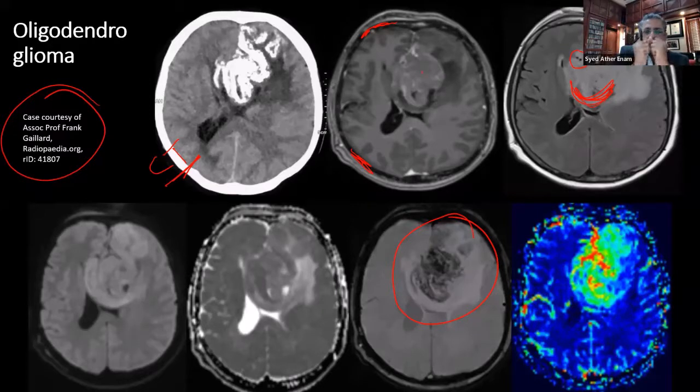But if the molecules are held in one place, and you excite them, and then you change the angle of the magnetic field, doing it exactly opposite, they will still be the same. So they will cancel each other out. And that is what you see as dark, because there is no movement of that water molecule. From the initial B0 to B1000, as you enhance the effect, it will not show because the water molecules are held in place. They're not moving a whole lot, and that's where they show us black.